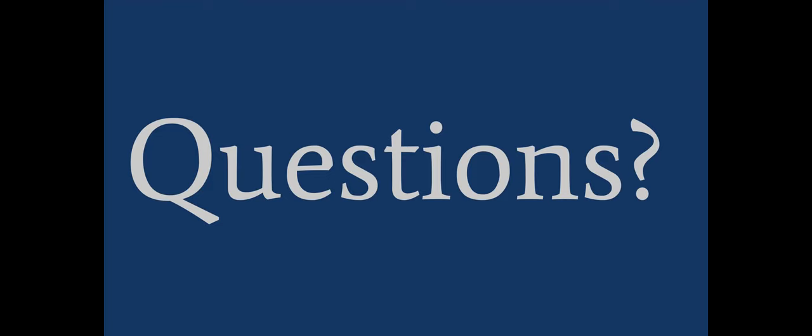Any more questions? Among all the techniques you presented, which is the one that is currently mostly used in clinical practice? It's the pseudo-continuous, the preferred technique. It's called PCASL. A lot of people in the field call it PCASL, and that sometimes throws you off. That's how they actually call it.